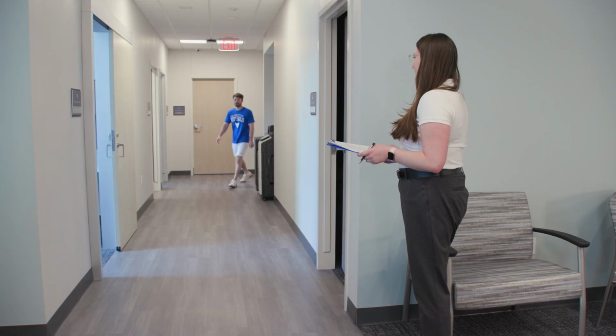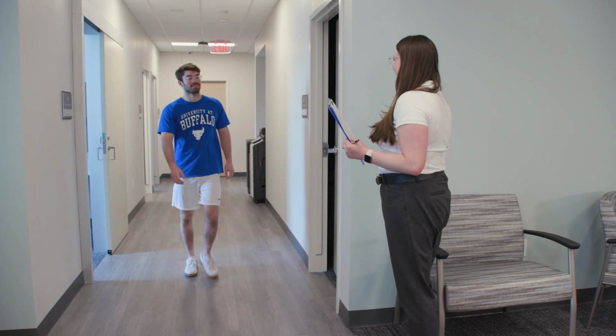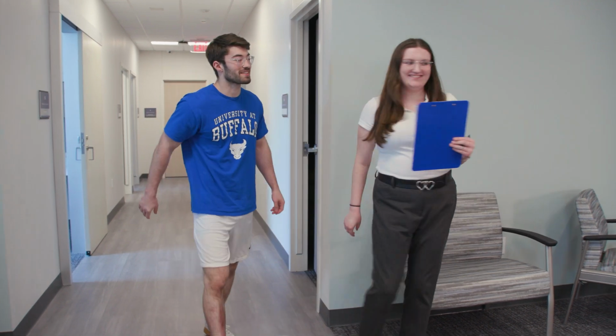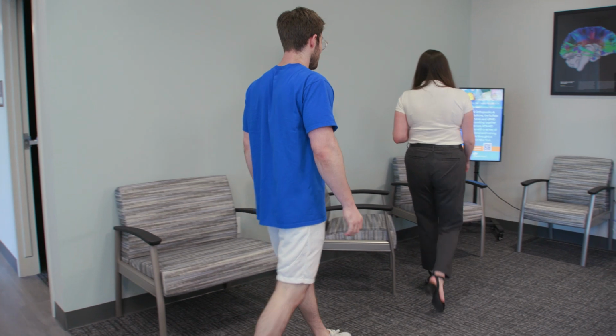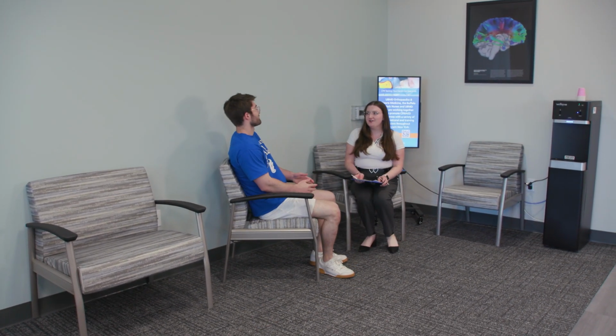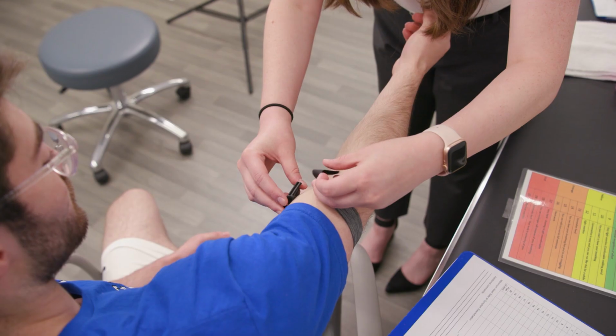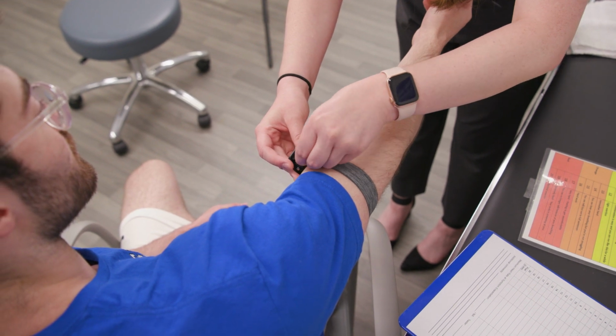To get started, ask the patient to arrive ready to exercise. Patients should be dressed for exercise in comfortable clothes and shoes and wear any vision or hearing aids they usually need. Patients should also be hydrated before completing the test. Begin by explaining the test procedure to the patient. Allow the patient to ask any questions. Inform them that participation is voluntary and that they may stop the test at any time. Have the patient wear a heart rate monitor per the manufacturer's instructions.